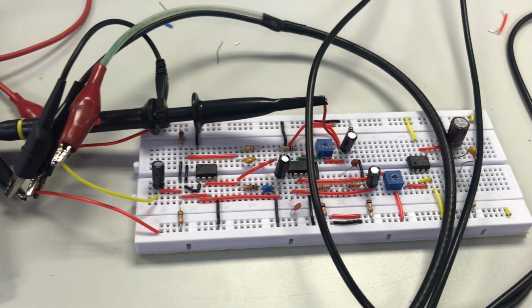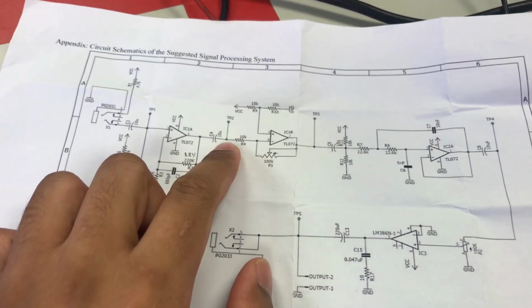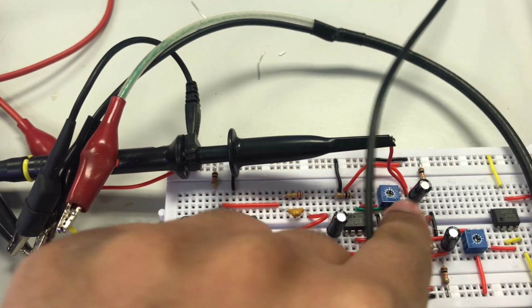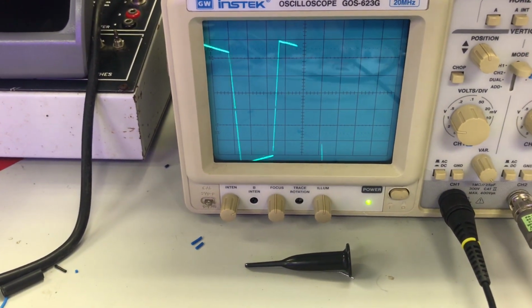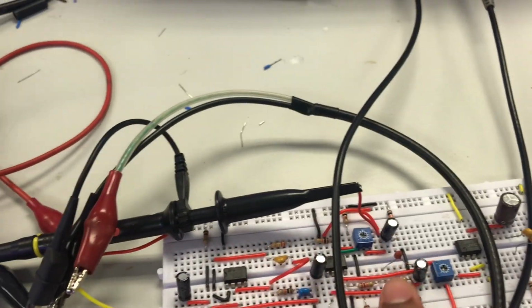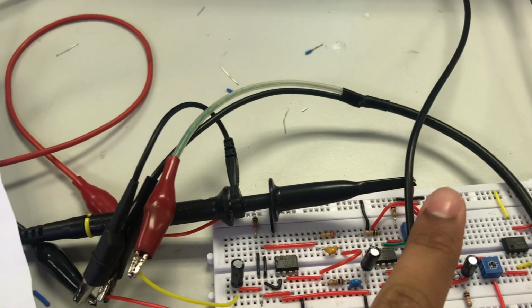This is my TP3. Since the testing point was here for TP2, I just shifted the probe from TP2 to TP3, which is here. So I shifted the probe here, and my waveform turned out to be square waves. All the settings are still the same, even the function generator is still the same. It's just that I am using different testing points. So this is testing point 3.